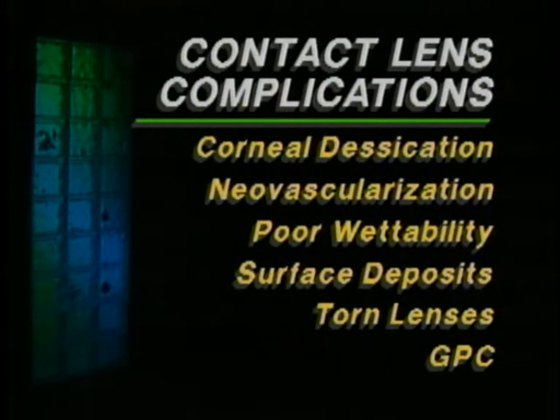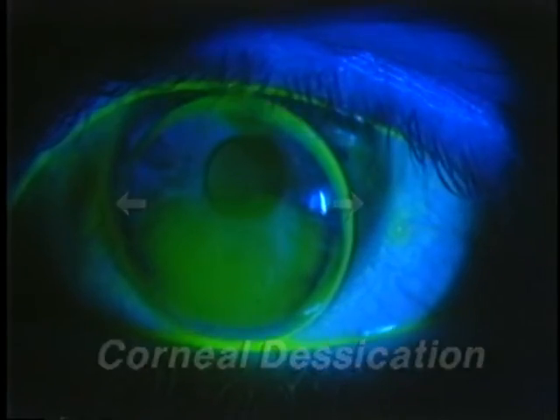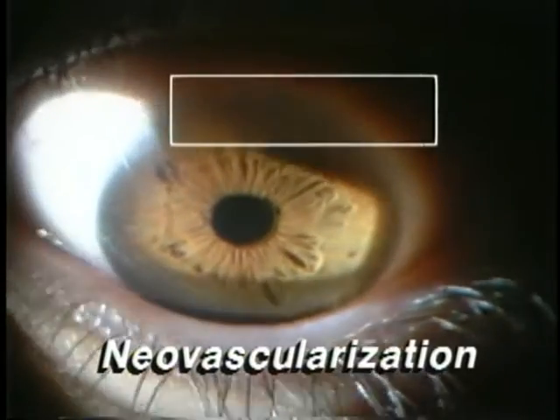Now that you are familiar with the basic illuminations, here are some clinical conditions commonly encountered in contact lens practice. Corneal desiccation, or three and nine o'clock staining, is viewed with diffuse illumination in combination with fluorescein dye and a cobalt blue filter. This condition, also known as punctate staining, pertains to the drying of the cornea adjacent to the lens edge, and over half of RGP lens wearers are affected in varying degrees of severity. Changing to high magnification, retro illumination reveals corneal neovascularization — blood vessels extending into the cornea, easily viewed against the illuminated iris in the background. This condition can be caused by corneal hypoxia, mechanical irritation, and infection, often due to contact lens wear.